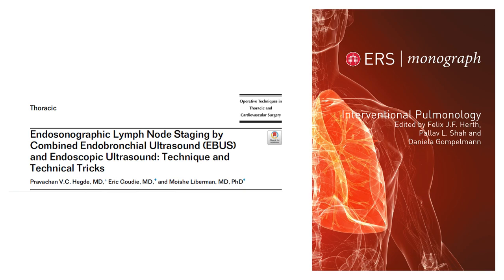First I would say start doing it with the EBUS scope in the esophagus, get familiar, and then once you get more familiar, then you can go with the conventional EUS scope after. The main challenge I see for someone who's starting would be, from a turf perspective, right?